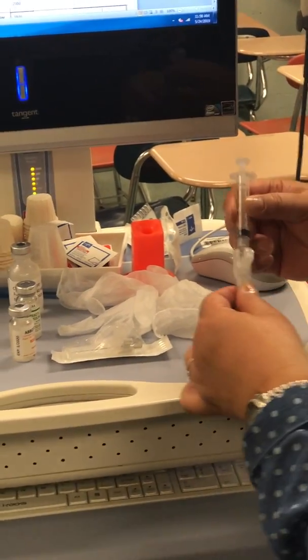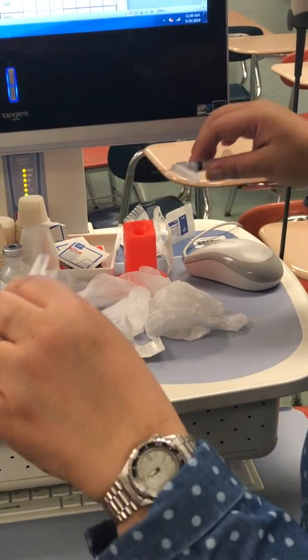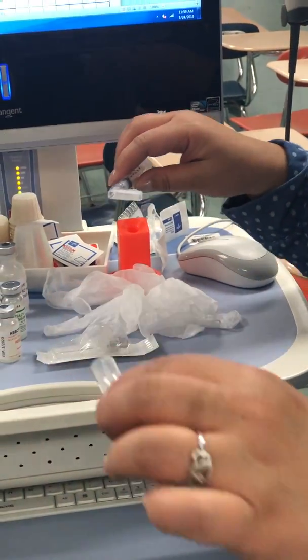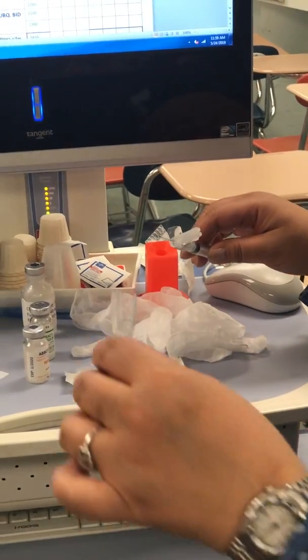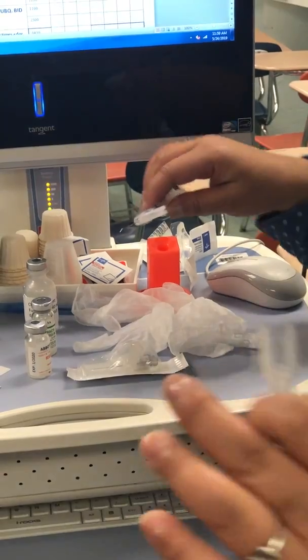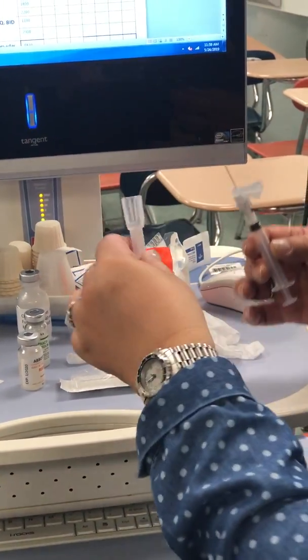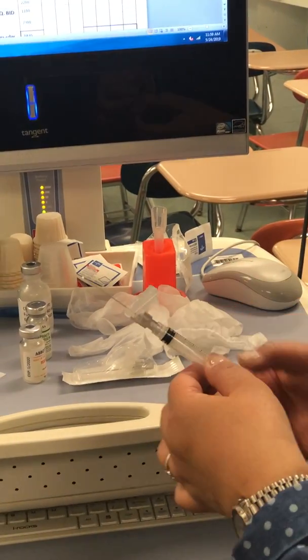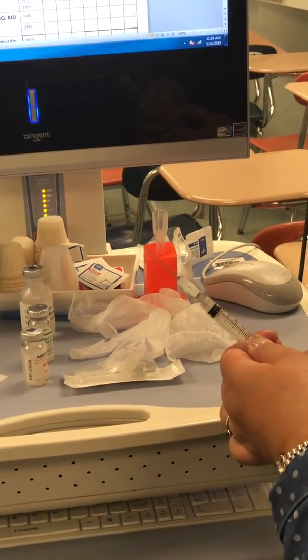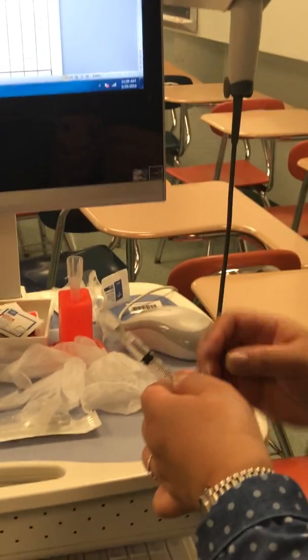So we're gonna, usually I tell students to go like this when you take out the cap because you have more space if you go like this. If you go up, you might come back and poke yourself, you know, it's for safety. So we get 1 ml of air, right?